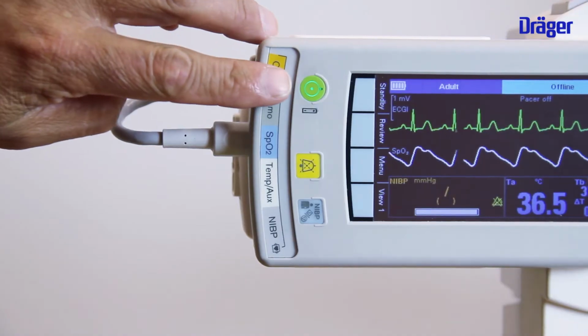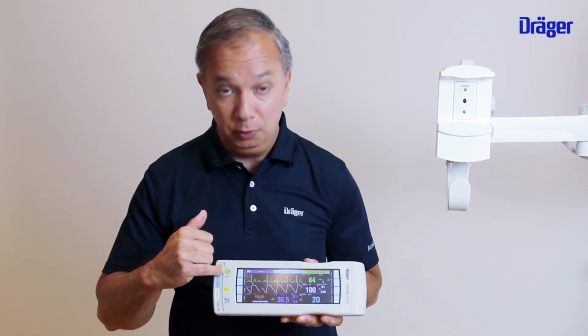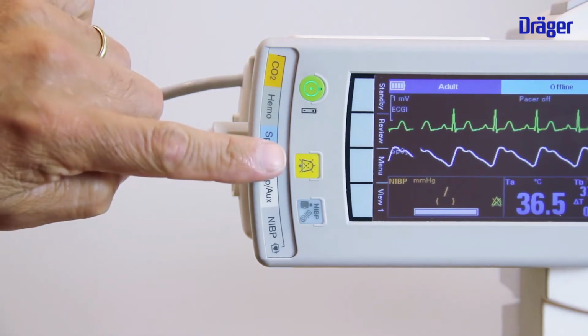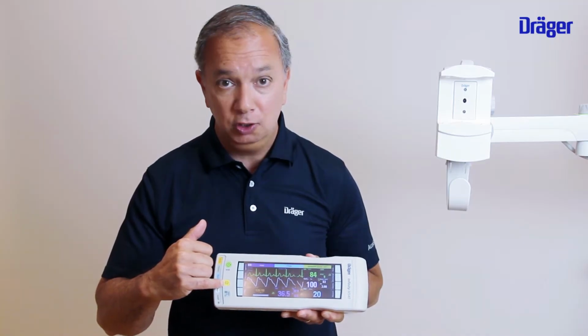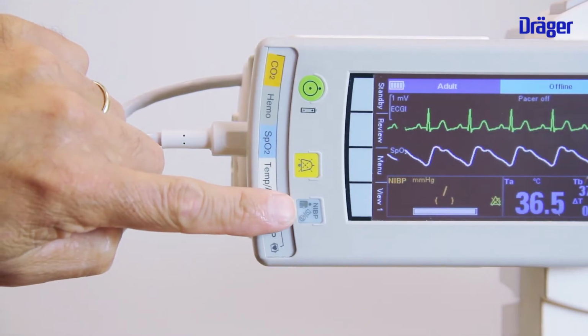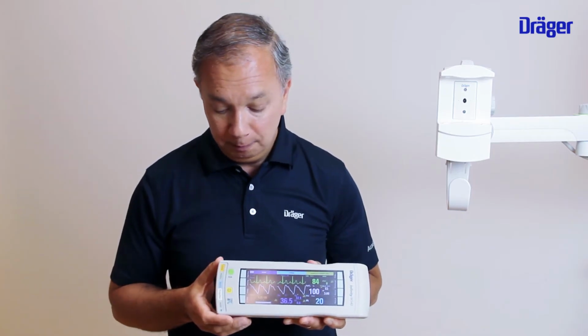When you go to the front, you have three different buttons, hard keys. On top you see the green one, which is the on-off button. So you can switch on or switch off the monitor with this green button. Then you have the yellow one, which is the alarm pause button. You can silence or suppress the alarms. And then you have your NIBP button, then you can start or stop an NIBP measurement.